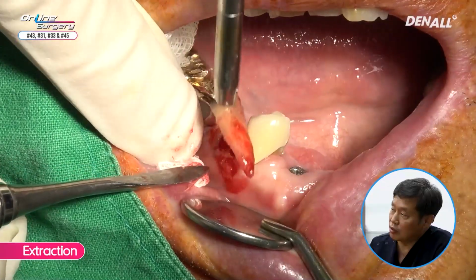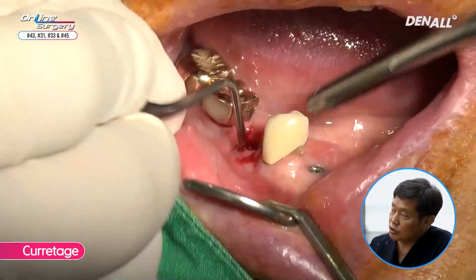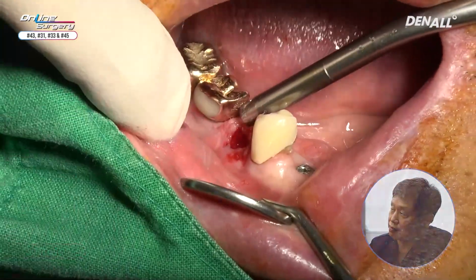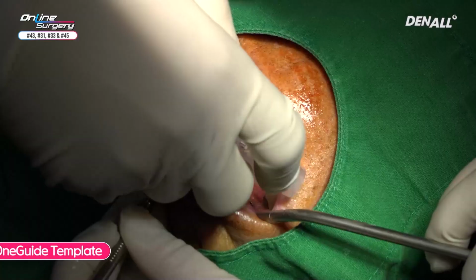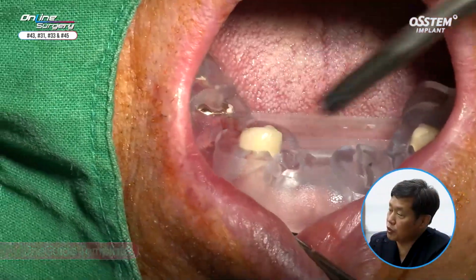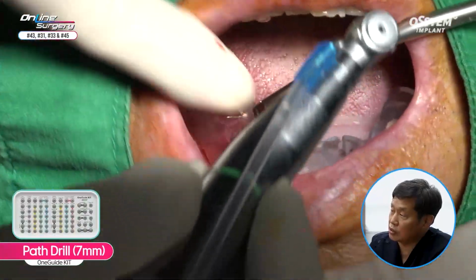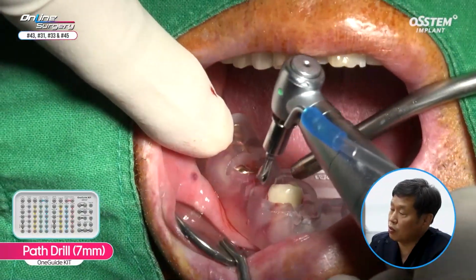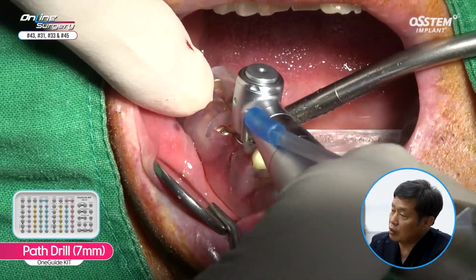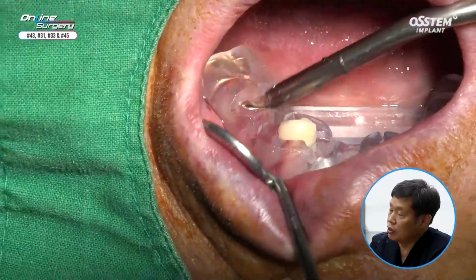Extraction was complete because immediate implant placement was planned. The curettage was done thoroughly. OneGuide template adaptation. As for lower anterior, healing was done. So adaptation was done after prep because this was extraction socket. OneGuide path drill 7mm was used.